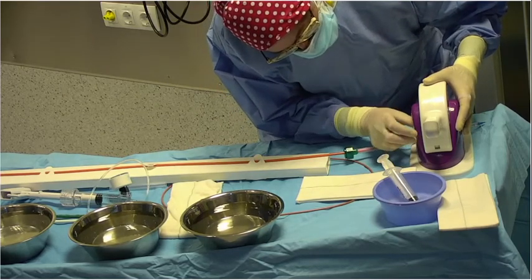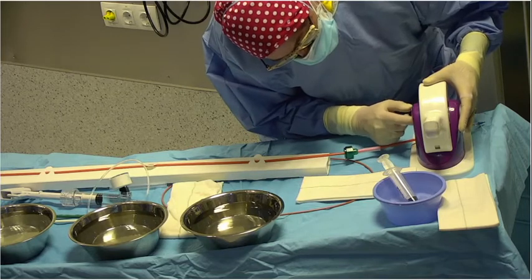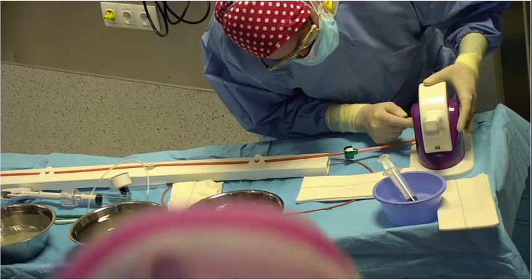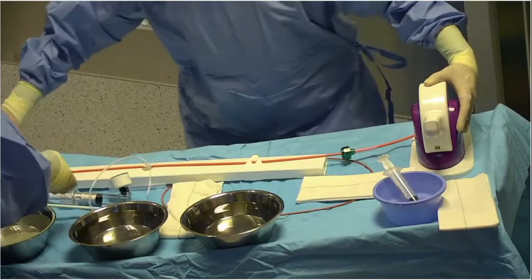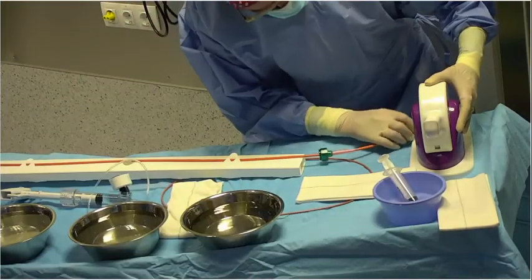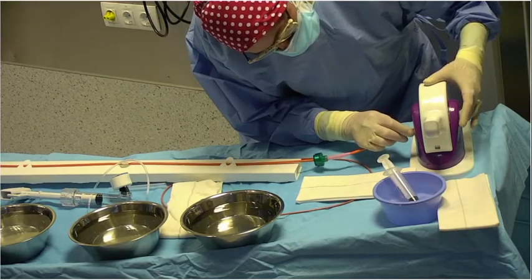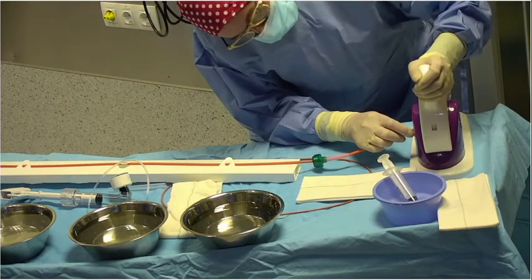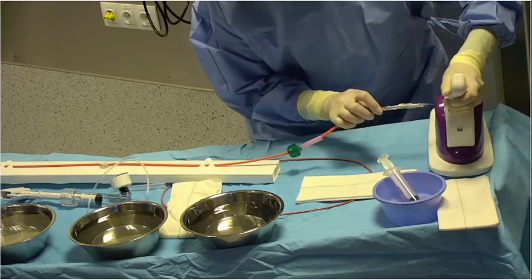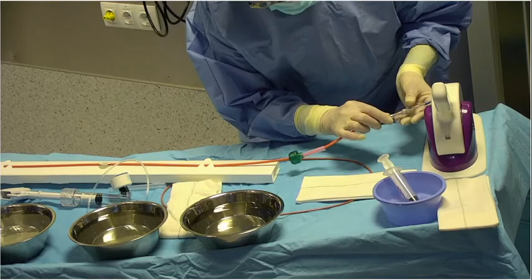Maybe we can show you how we install the Python introducer, if you agree, an introducer. We are going to dilate the introducer with the D20 before inserting it. Okay. Won't that be too much? Don't you bleed a bit with this big one? So, we are going to prepare... You will be using this French introducer? Sorry, Alain? You will be using the 14 French introducer that you have to dilate with the 18 French dilator, if I understood, yeah? Yes, yes, exactly. Okay. So I'm going to remove my 11 French introducer now.